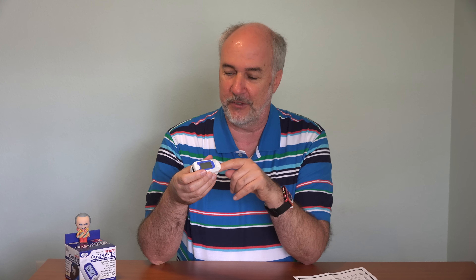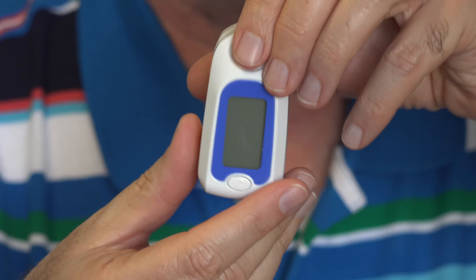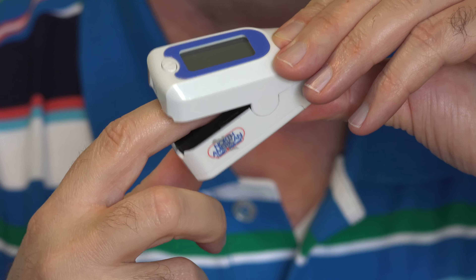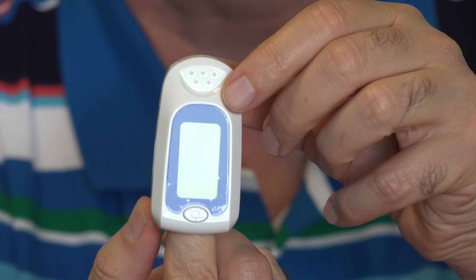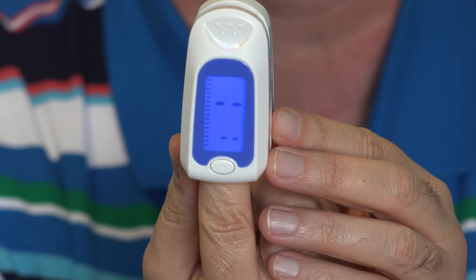Between 80% and 100%, it's 2% accurate. The pulse is also within 2%. The screen briefly lit up when I put the batteries in. I'm going to put the back cover on. A nice thing with this is it shuts off automatically — once you've pulled your finger out, after 8 seconds of there being no finger, it will just shut itself off. The power button to turn it on is right here. Let me zoom in and let's take our first measurement.